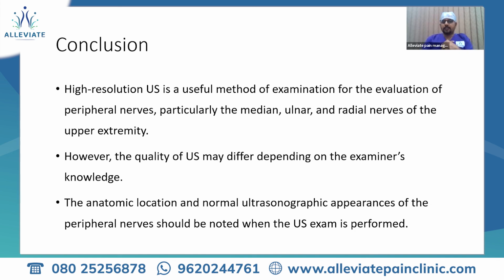However, the quality of the ultrasound image may differ depending on the examiner's knowledge. The anatomic location and normal ultrasonic appearances of the peripheral nerve should be noted when the ultrasound is performed, and should always be compared to the control side.